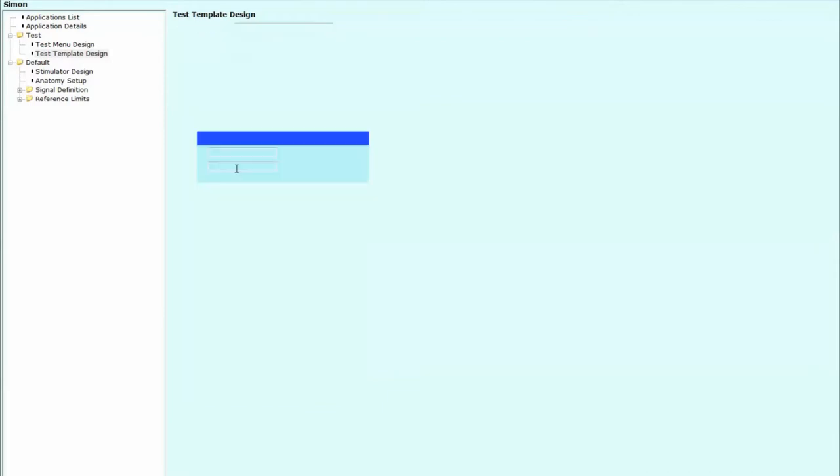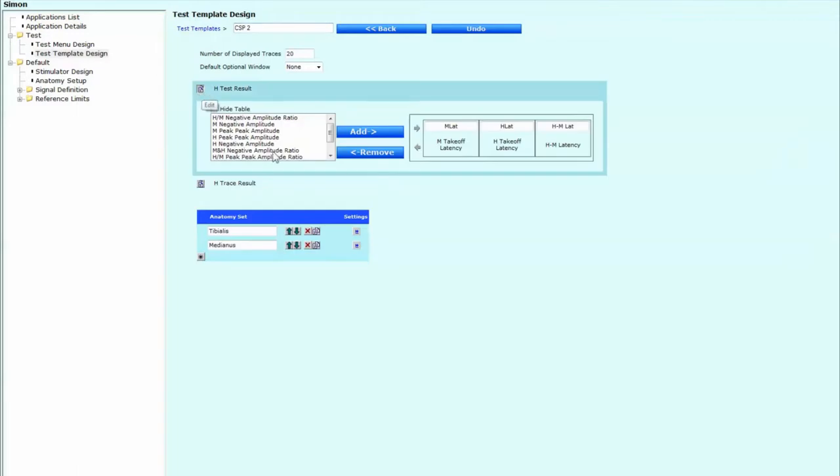Then we're going to double click into it. And we're going to change its name. So ordinarily, what you would do is just type in CSP. But for our purposes, because I've already done this, we're going to call this CSP2.